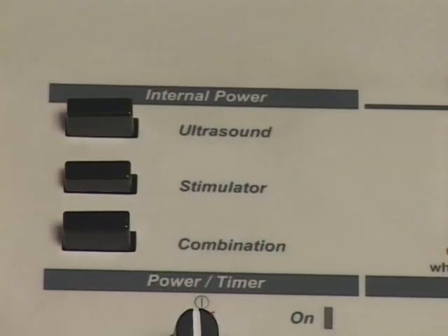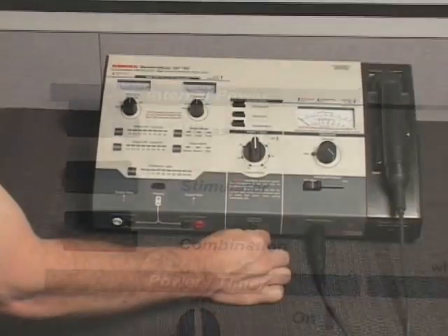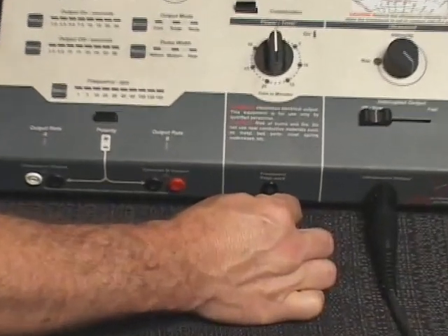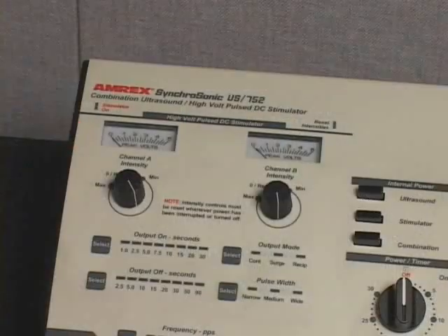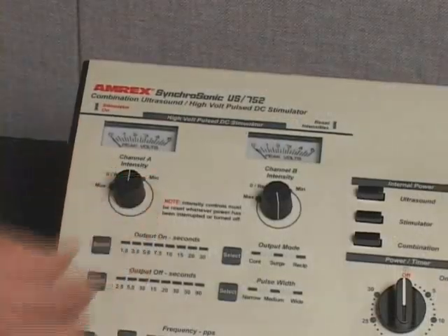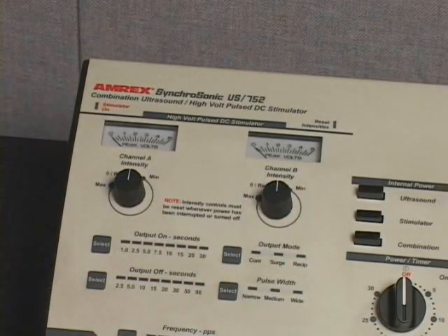Depress the internal power stimulator switch to the ON-DOWN position. Connect the patient treatment stop switch to the treatment stop jack. Reduce the channel A and channel B intensity controls to the zero reset position, enabling the audible tactile clicks.